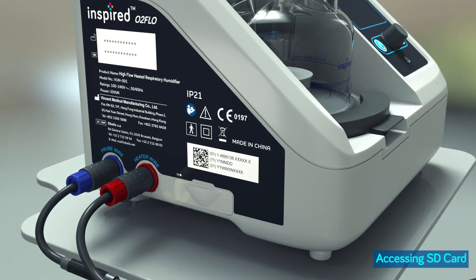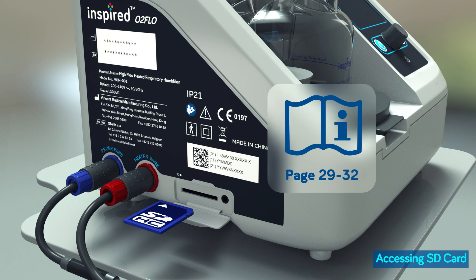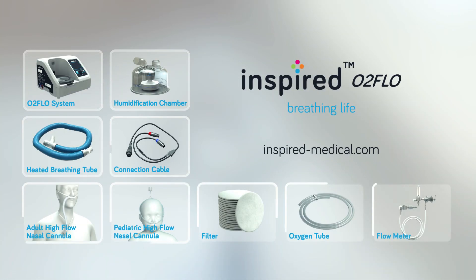To access the SD card, open the cover and press on the card — the SD card will be ejected. Refer to pages 29 to 32 of the O2 Flow operator's manual for instructions to operate the software. Please visit our webpage for the accessories list and technical information.